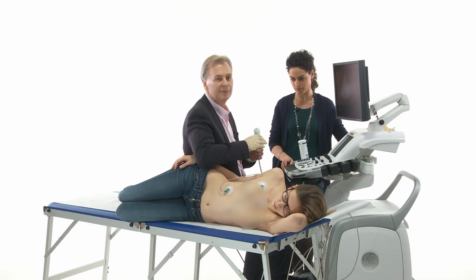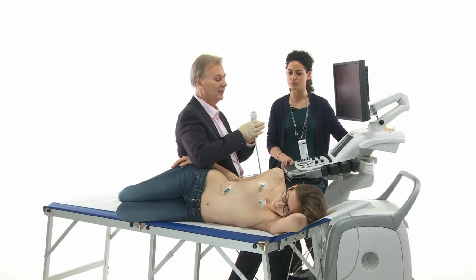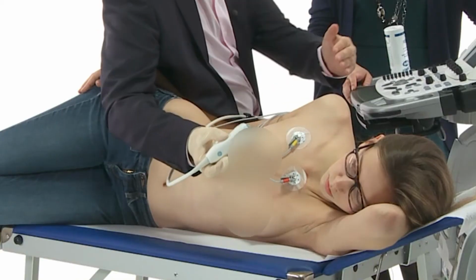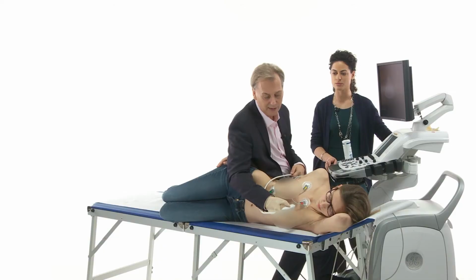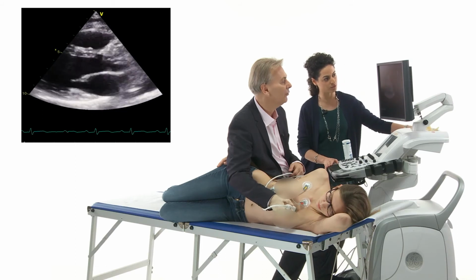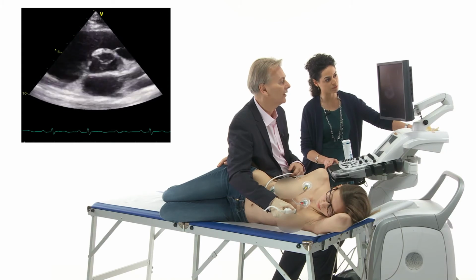Yes, I will use the same approach that you've already learned, where we use the parasternal window. Now, as opposed to looking at the left ventricle, however, we're now using a view which is a little bit more cranial at the base of the heart. How do we go about it? Again, we take our transducer and we orient it to the right shoulder. So we're using the parasternal long axis view that we saw before. We put the transducer, get the parasternal long axis view, and then we simply rotate the transducer clockwise until we get a short axis view.